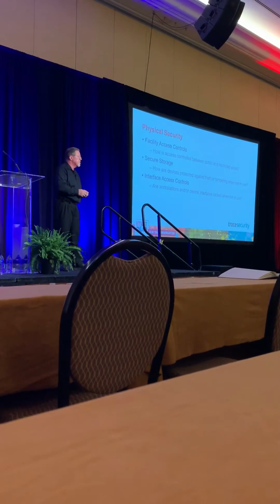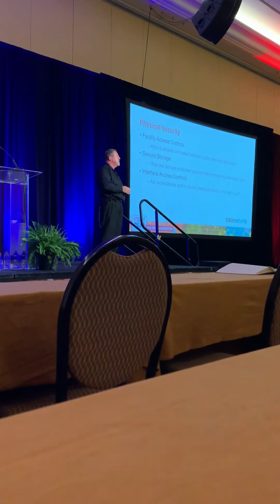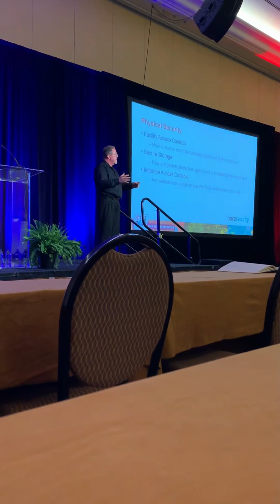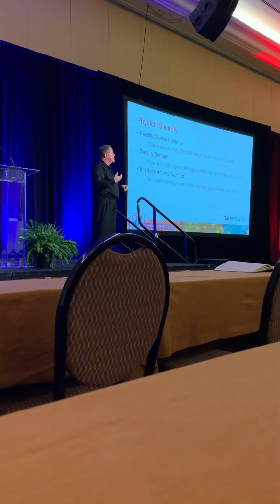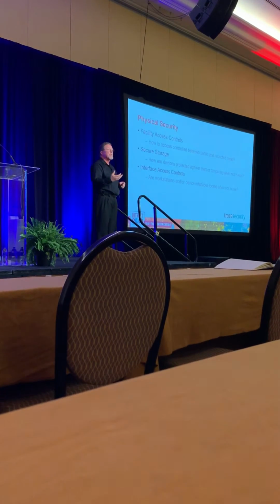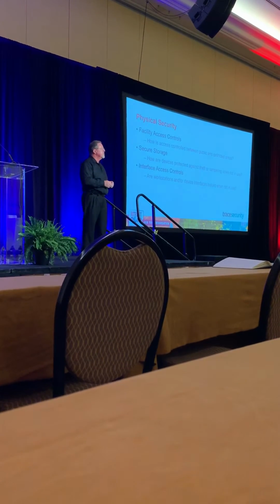Physical security, not much to say except that in a clinical environment or in a care environment, access to facilities needs to be fairly open. And so sometimes it takes a little bit of thinking and a little bit of strategy to determine how you are going to control access in and out of non-public or restricted areas of the facility.